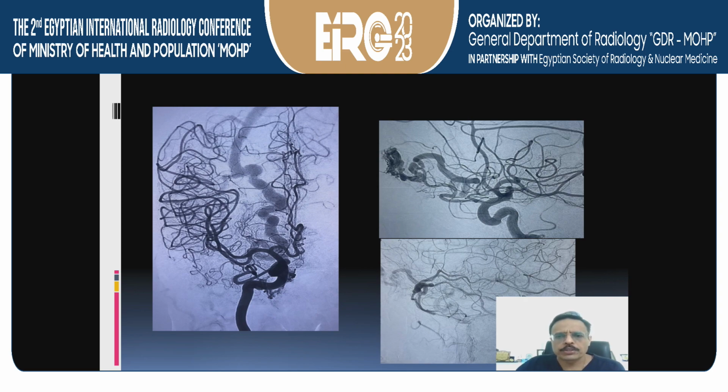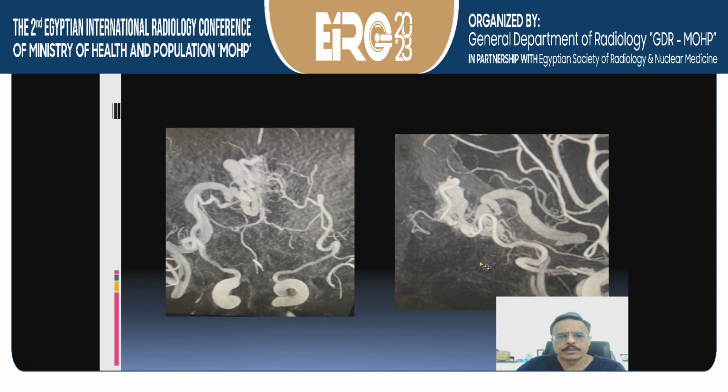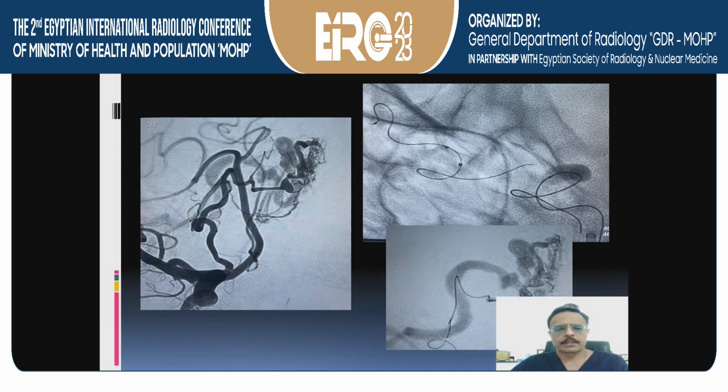This is another patient with a dural AVF, but the transvenous route wasn't very amenable in this patient. There were ECA feeders, bilateral ECA and ICA feeders, and 3D anatomy showing the dural AVF in the cribriform plate. So we decided to go transarterial. Once you go beyond the origin of the critical arteries in the ophthalmic, there is a turn which is always there. We can know that is safe, but the problem was it was very tortuous.